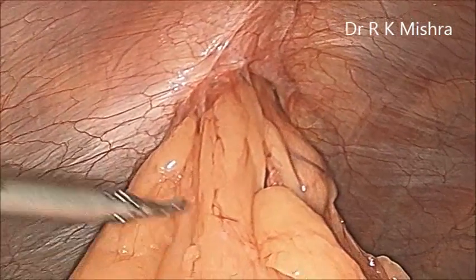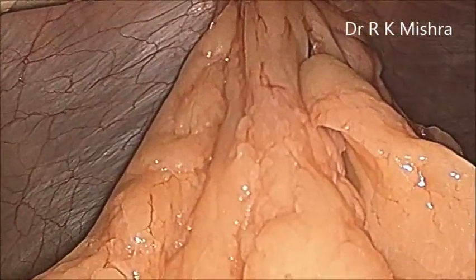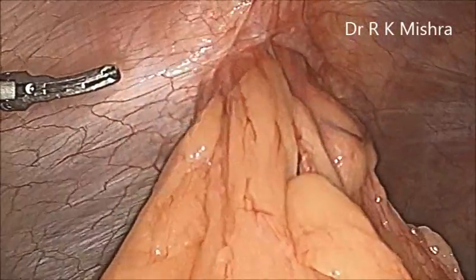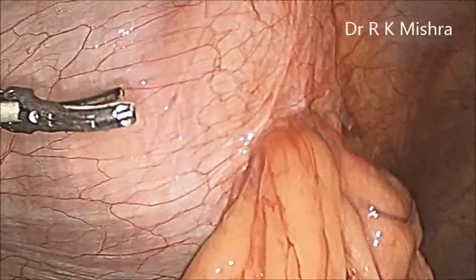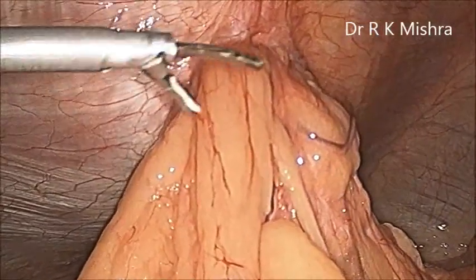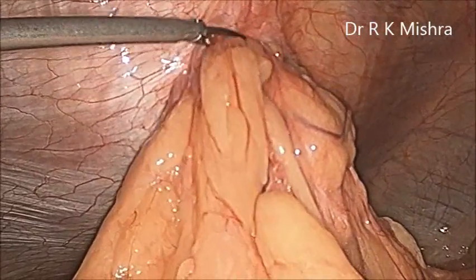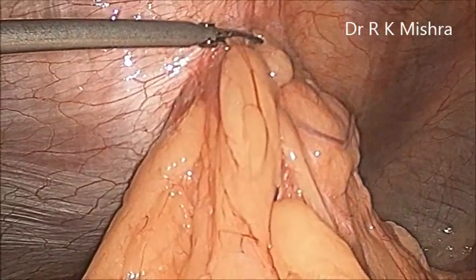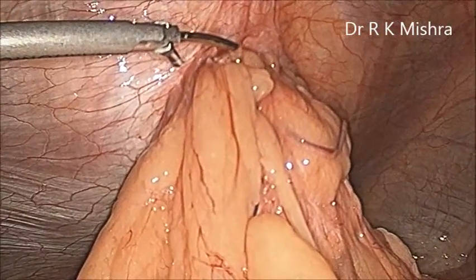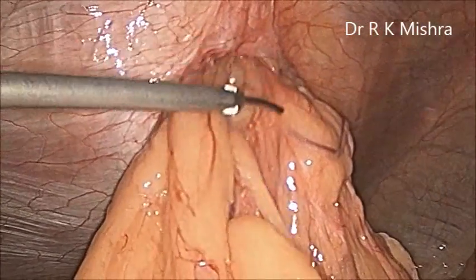That mesh is Pro Visc 160. It is a dual-side mesh for intra-peritoneal placement. The composition of this mesh is polyurethane on the visceral side, which has a blue color, and polyester towards the abdominal wall — that is the parietal side, which is white color. So this is a dual-side mesh for intra-peritoneal only mesh repair of ventral hernia.